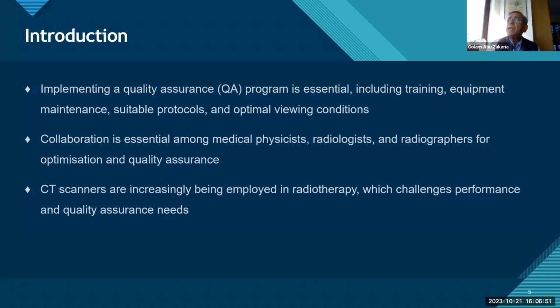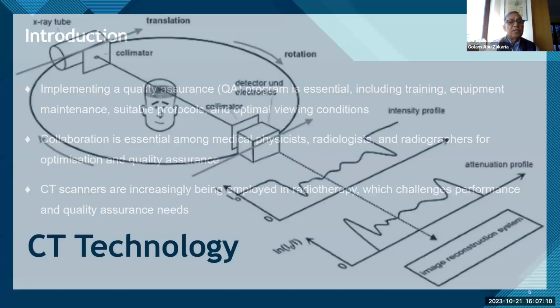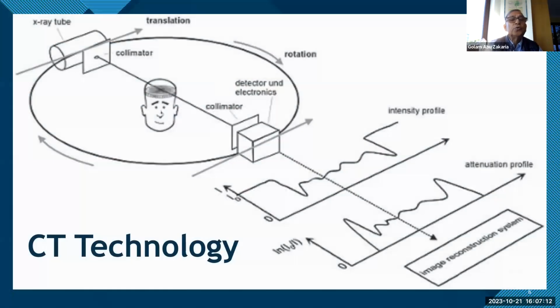You can apply the dose with millimeter exactness, because you have three-dimensional CT images, and it gives you possibilities in all dimensions to do this. And this is the CT technology. I will not go into details.